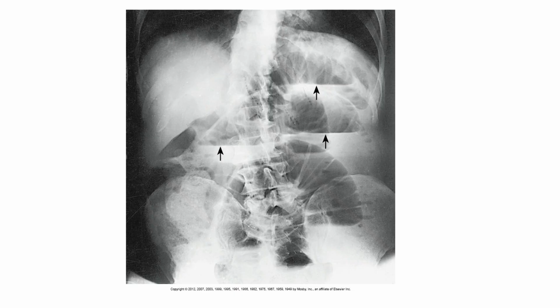Okay, there's a huge difference in the absorption of X-rays between air and liquid, and that distinction shows up as a horizontal line whenever you shoot with a horizontal X-ray beam, like in an upright abdomen projection. Okay. And so we always see this meniscus sign that always tells us that this is the upright.